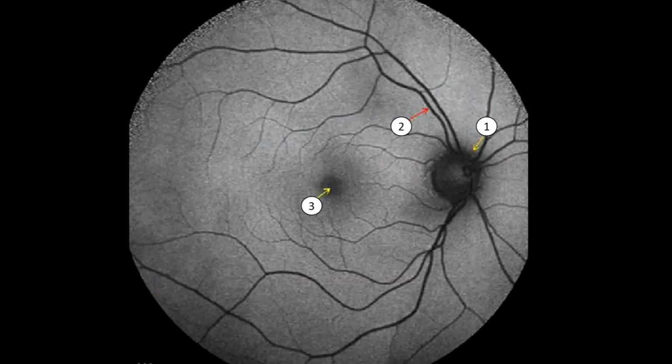So how does a normal FAF image look? This is a normal FAF image. As you can see, the fovea, disc, and the blood vessels are all hypoautofluorescent, while the rest of the fundus is isoautofluorescent.